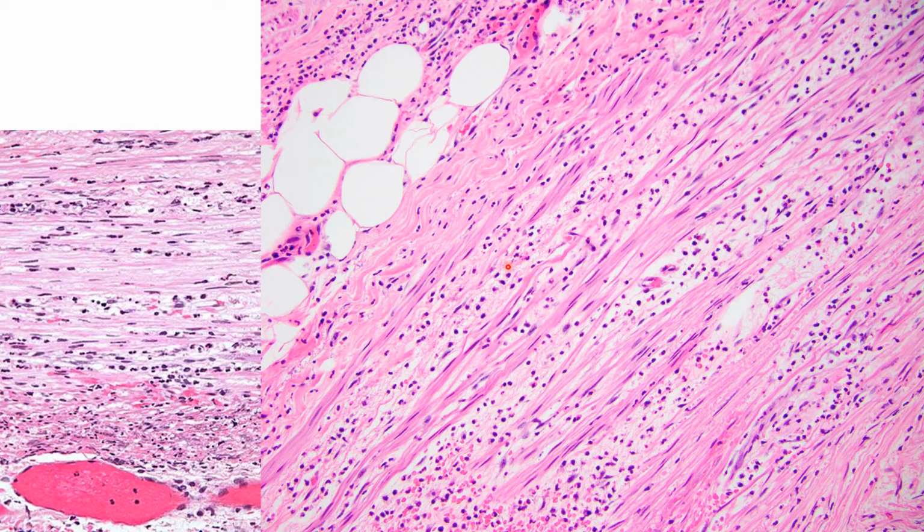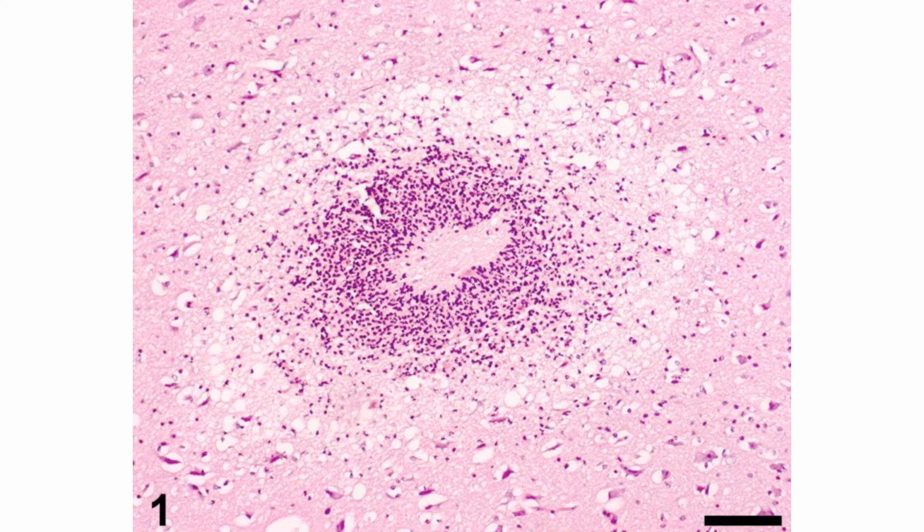If you look closely, they consist of multiple lobes, and these are neutrophils. And most importantly, where do the neutrophils come from? They come from these blood vessels. This is dilated, this is also dilated, and the most prominent one is this one. These are dilated blood vessels, and the neutrophils come from here and go into the interstitium.